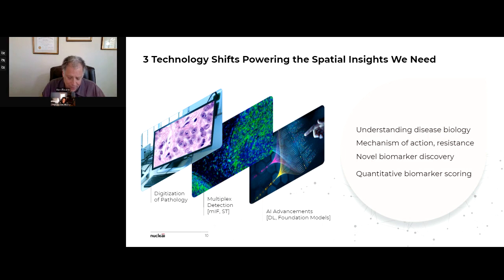While the concept of pathology-aided interpretation and the use of artificial intelligence in medicine is not new, it is the widespread emergence of 3 technologies that are driving its use in pathology. These include the digitization of pathology slides, the development of multiplexing technologies, which allow us to more comprehensively describe cell types and cell states, and advancements in artificial intelligence, such as deep learning and foundational models.